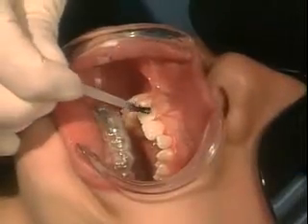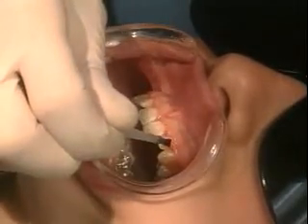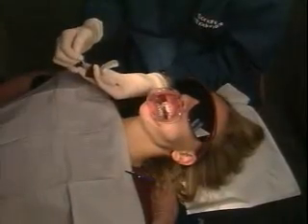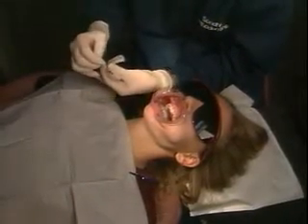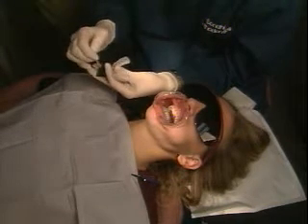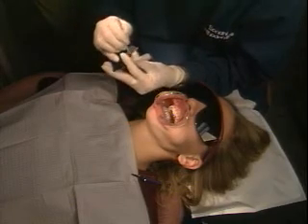Repeat the preparation and isolation for the upper arch using the same technique. Paint a thin layer of Resin A on the upper teeth. Paint a thin layer of Resin B on custom resin bases using a different brush. Note that the resin working time is not an issue until Resin A and Resin B finally come into contact.